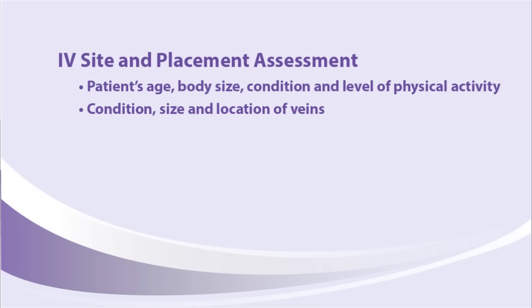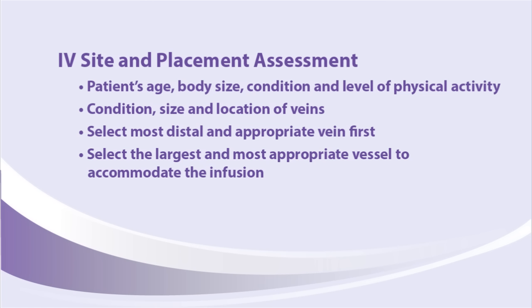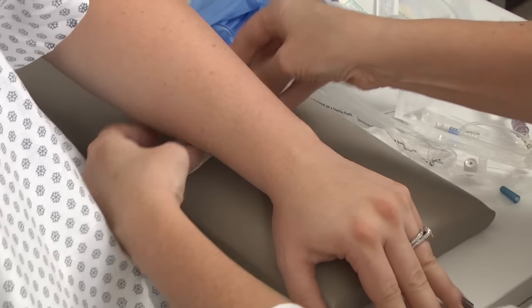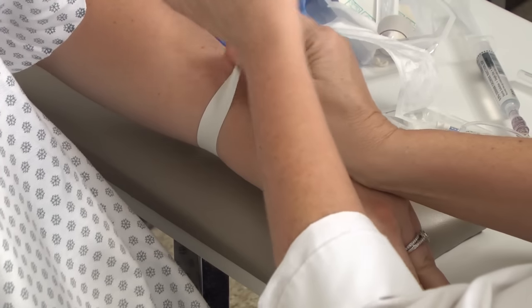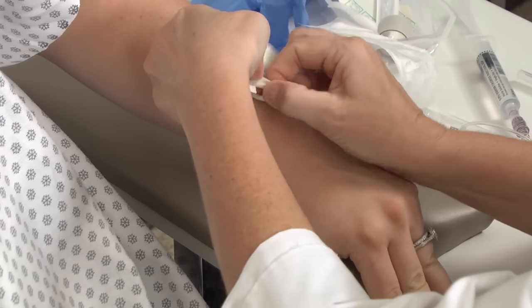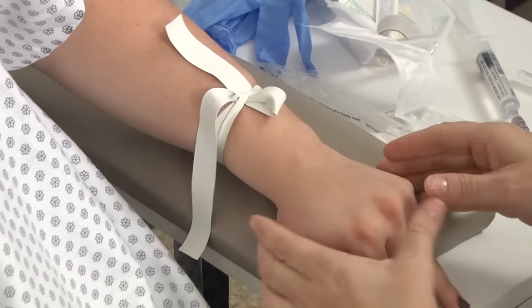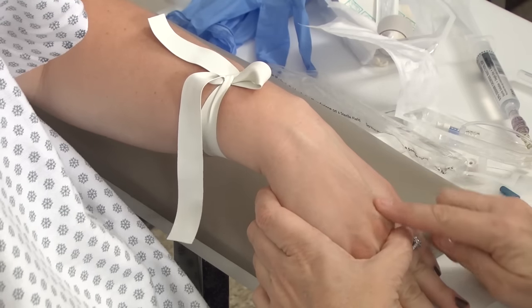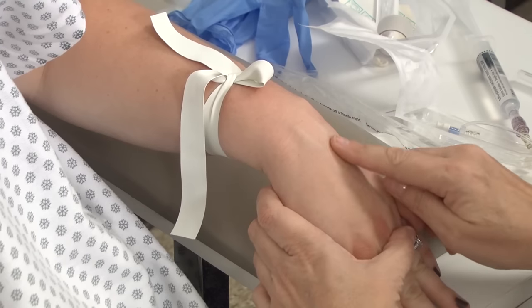The nurse needs to consider the patient's age, body size, condition, and level of physical activity, as well as the condition, size, and location of veins when choosing a vein for the IV. Ideally, select the most distal, largest, and appropriate vein first to accommodate the infusion — this is especially important if the patient will be receiving IV therapy long term. Apply the tourniquet approximately four to six inches above the desired site. The tourniquet needs to be tied in a single hand release loop, similar to how you tie a patient's restraint. Avoid joints and wounds when applying the tourniquet. The tourniquet will cause the veins to dilate and make them palpable — they should feel squishy, like a fishing worm.